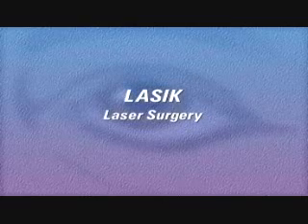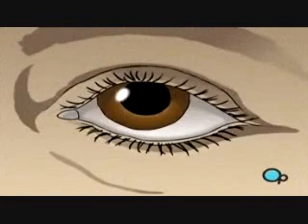Your doctor has recommended that you undergo laser in situ keratomileusis, or LASIK laser surgery, to correct a vision problem. But what does that actually mean?